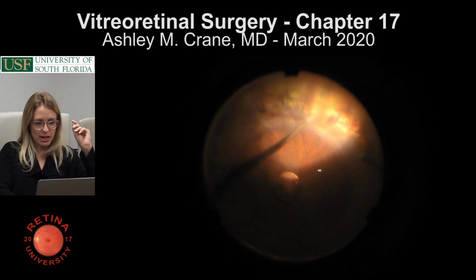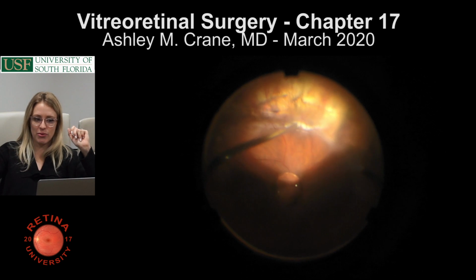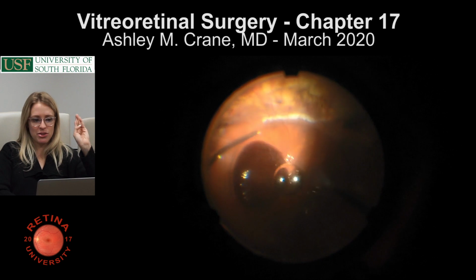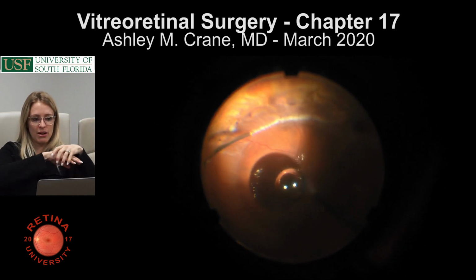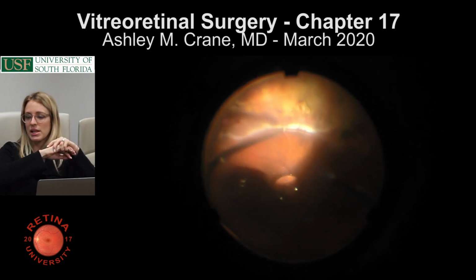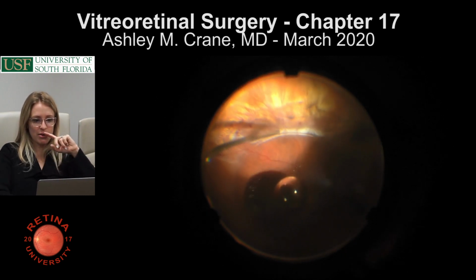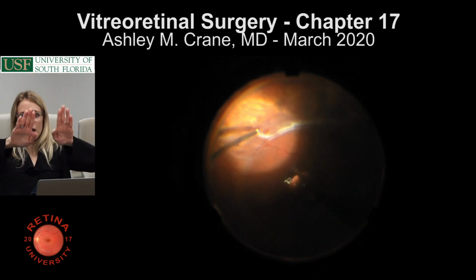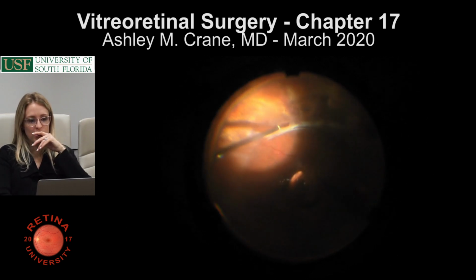So this is marking of the retinectomy with endodiathermy. So you have to cauterize the edge of where you're going to cut. At least these retinectomies are usually at least 3 clock hours, and you're trying to make it really peripheral so you're not losing a lot of space. If it doesn't work and you need another retinectomy, you don't want to be on top of the macula. So you're doing as peripheral as possible. I'm just going to cut out basically the retina. And basically then the retina was taut, and then it's just going to lay down and you're going to laser it flat there. So this is what a retinectomy is.